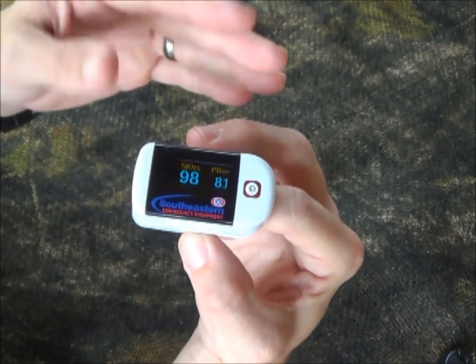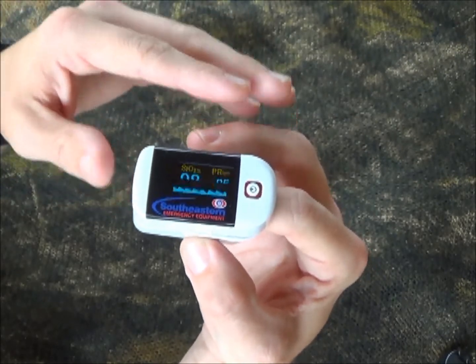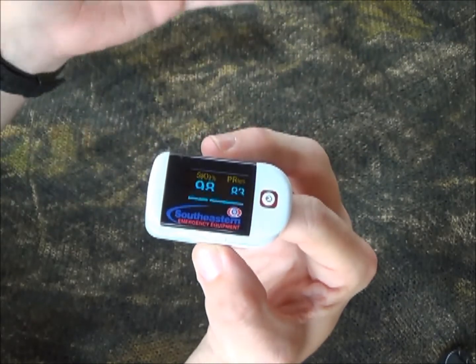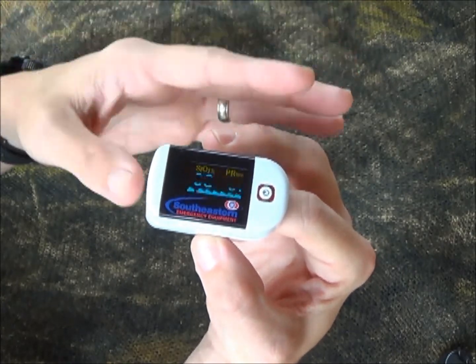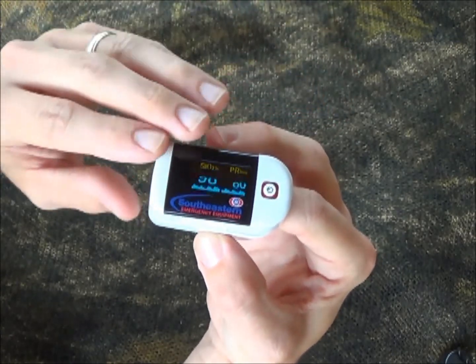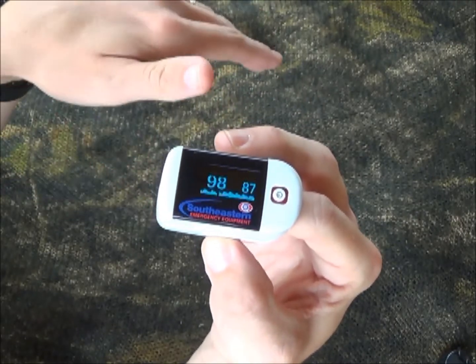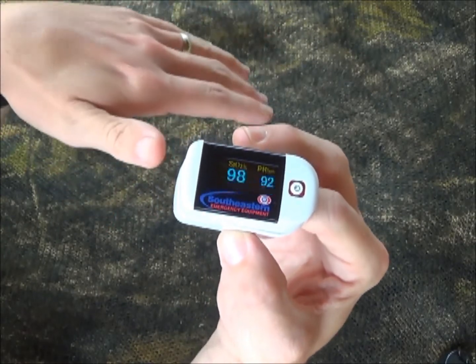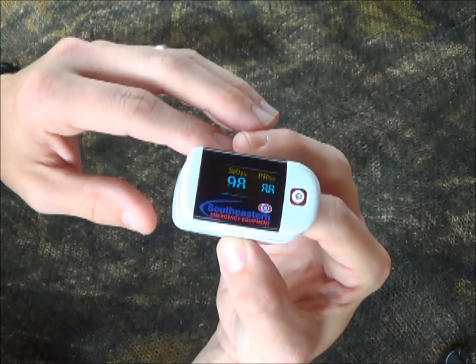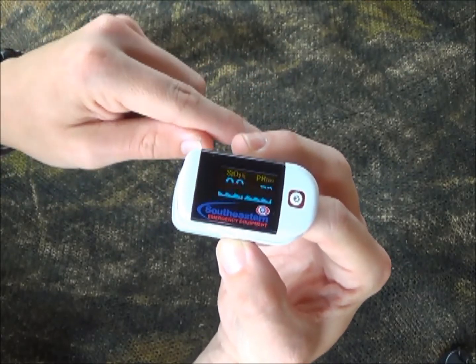Another thing to remember: if you're dealing with someone who's been in a house fire, whether that be a firefighter or a victim, carbon monoxide also attaches to hemoglobin — it attaches quite well. This device does not have the ability to measure the difference between what is oxygen and what is carbon monoxide. So if you have someone who's beet red that's been in a house fire, you may actually be reading the amount of carbon monoxide attached to their hemoglobin, not necessarily the oxygen level.